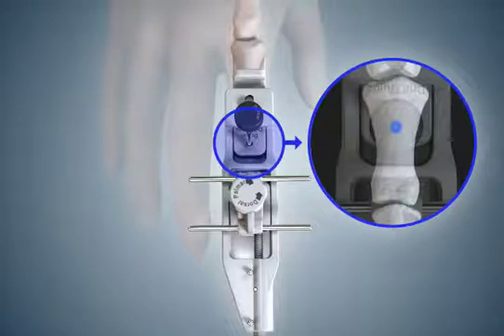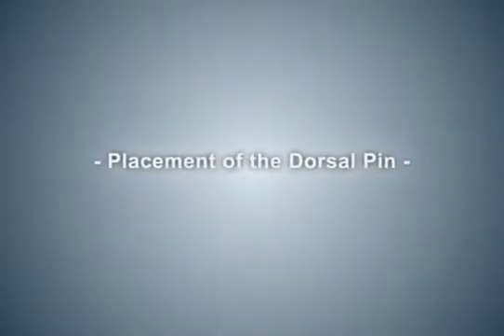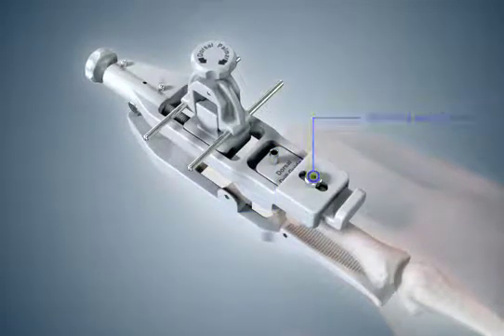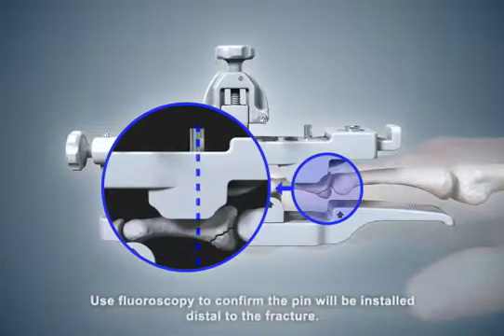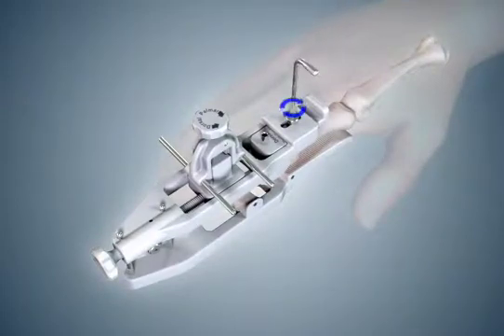Proximal-distal placement of the dorsal pin is determined by the fracture pattern. For correct positioning of the vertical dorsal pin, adjustment of the dorsal drill guide may be needed. Loosen the dorsal lock screw with the hex wrench, then slide the dorsal drill guide proximal or distal as needed to ensure the dorsal pin is placed slightly proximal to the mid shaft of the middle phalanx but distal to the fracture. Lock the dorsal drill guide by tightening the dorsal lock screw.